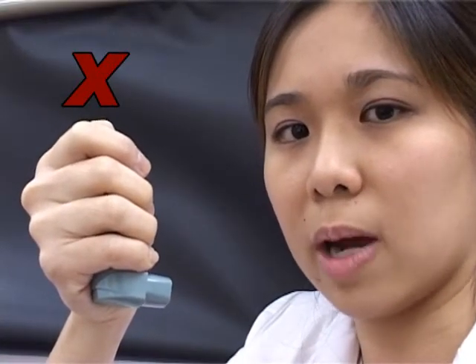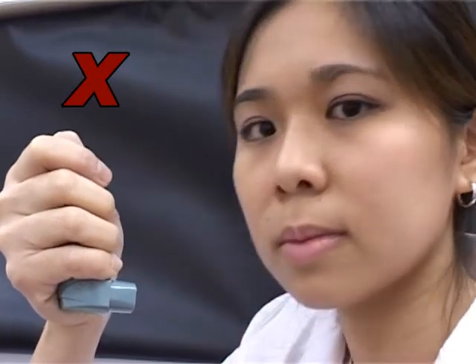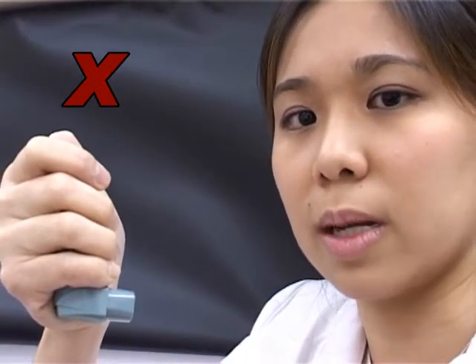When you breathe out, do not breathe out into the inhaler. Ensure that you press the inhaler and breathe in at the same time. If the timing is wrong, the medicine may not go into your lungs.